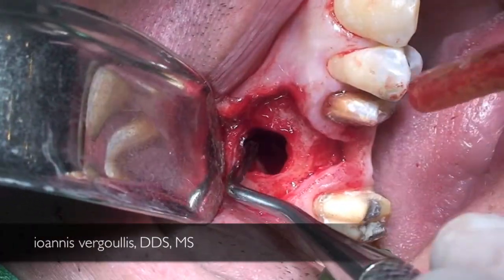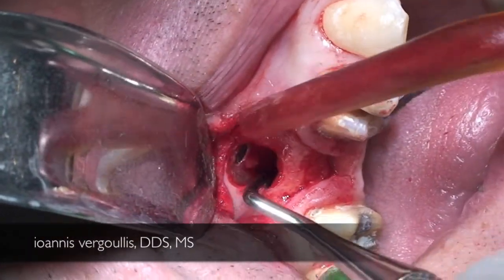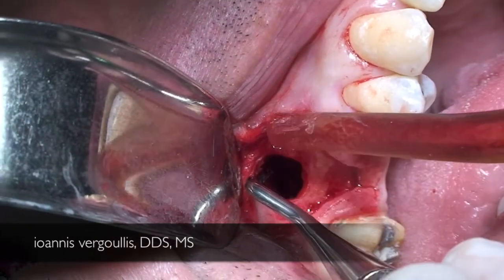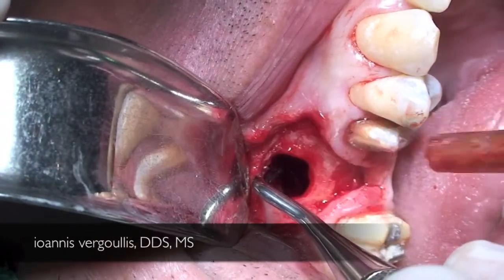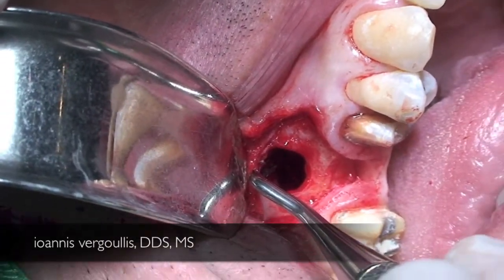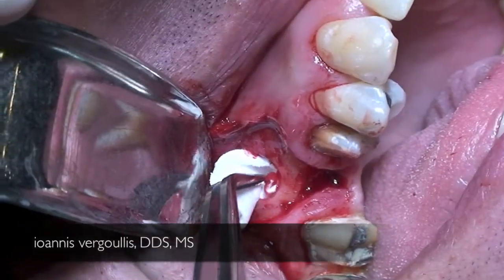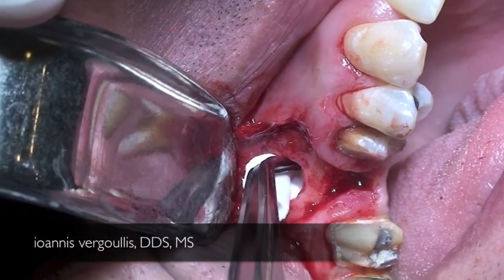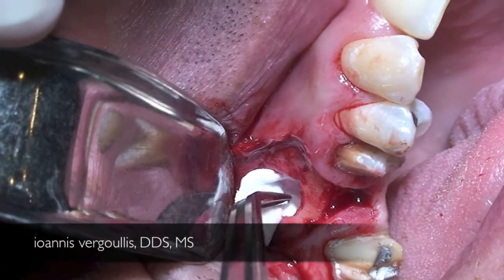We proceeded with the lifting of the membrane all the way to the medial wall, and following that we utilized a collagen membrane in order to fully cover the small perforation present on the Schneiderian membrane.